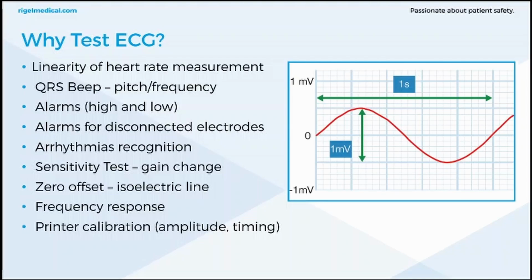So if a condition is alerting the clinician, does it have the right pitch and amplitude? Because clinicians use these pitches and amplitudes to quickly monitor a patient's condition.